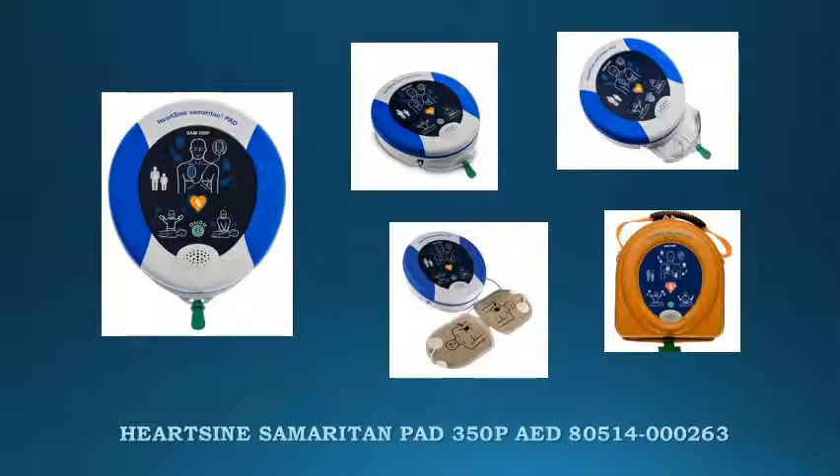This AED is lightweight at 2.4 pounds, small, and highly water and dust resistant. A top feature is that the HeartSign 350P uses HeartSign's Practical Pad Pack, which incorporates the battery and electrodes in a single-use cartridge, meaning only one expiration date to monitor and only one item to replace after use.